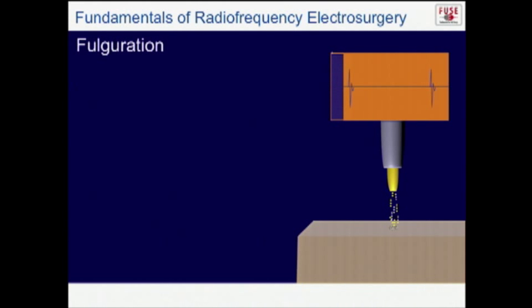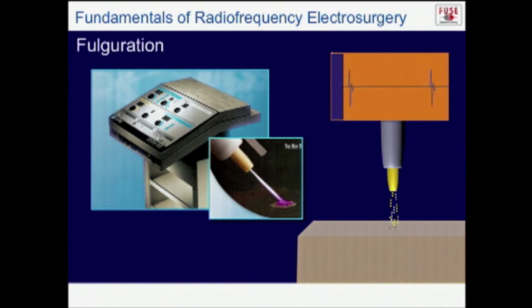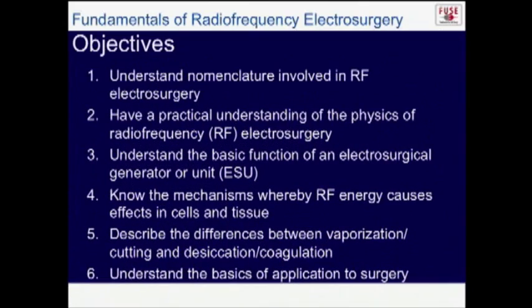Now, can you use this to cut? You can. And Randy's going to talk about that today, I know. In high voltage, or in high impedance tissue, you do need high voltage. You can dial it up by going to blend. You can dial it up by going to a higher output on your cutting side, and we can talk about what might be more or less safe there. Or you can use the inherent high voltage in the so-called Coag output. And this graphical depiction is really using an inert gas like helium, or in this case, argon, to actually help focus that energy on tissue.